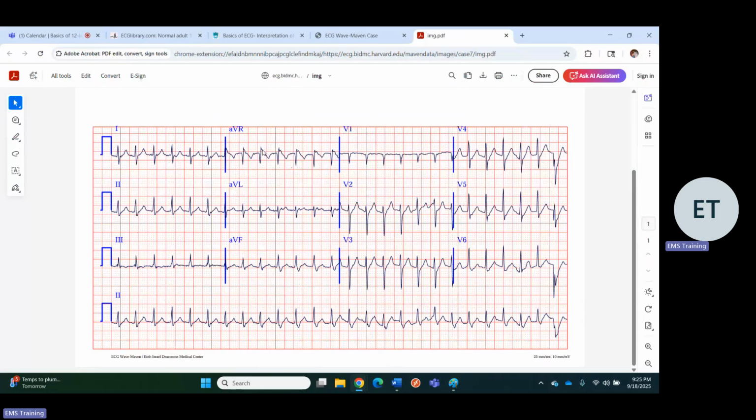There's a large R prime here. When things start going on with AVR, I suspect that the rhythm's not originating in the sinoatrial node. Like the second half of this, it's going towards it. So somewhere down near the junction, the AV node. Well, let's find out some context.